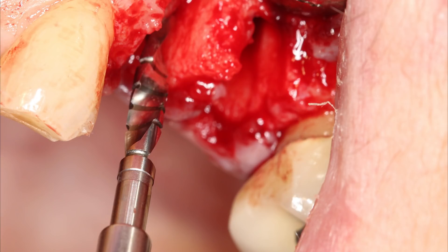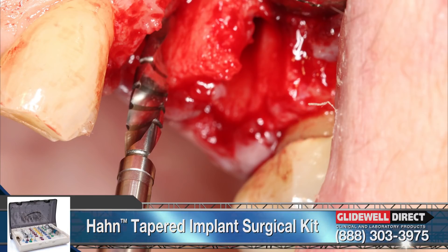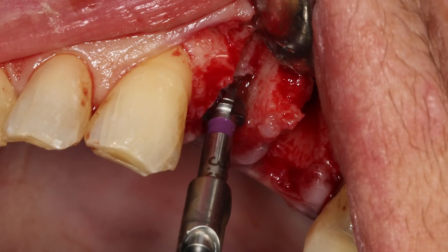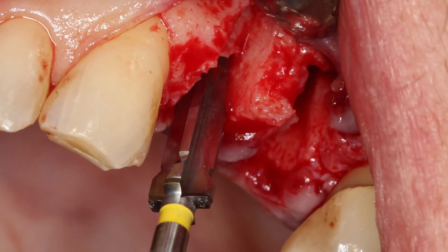Osteotomies were formed for two 4.3 millimeter diameter Han tapered implants in the areas of tooth number 12 and 13. A 2.4 millimeter twist drill was used to create the initial openings into the bone on the palatal aspect of the sockets. Because some bone re-contouring at the crest of the ridge is expected in an immediate extraction site, the osteotomies were created at a depth to position the implants about a millimeter subcrestally into the socket. The twist drill was used to establish ideal mesial-distal angulation and proper depth. The 3.5 millimeter diameter shaping drill was used to widen the sites, and a radiograph was taken to ensure proper positioning. The osteotomies were completed with the 4.3 millimeter diameter shaping drills.